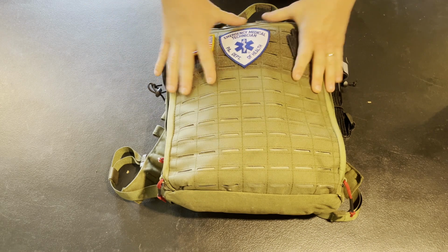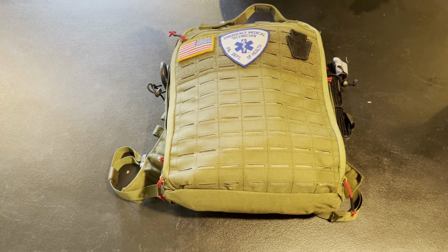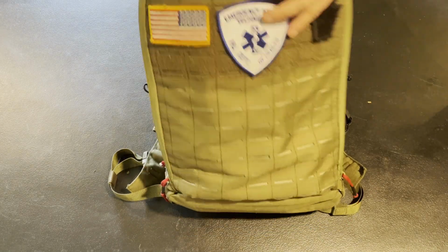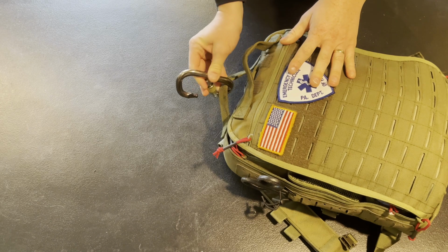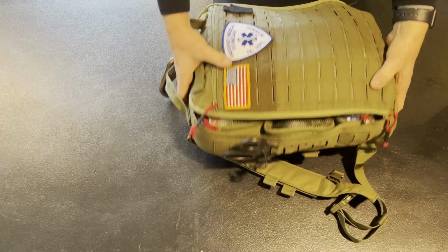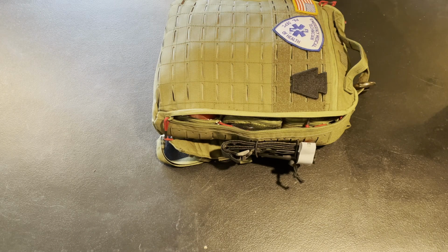The only thing that I don't have in here that I would normally have at my job is oxygen. That's it, yeah. Okay, so the bag itself I got from Amazon. It's nothing nice. I do like that it has the clamshell that opens up this way. On the outside I have a large carabiner, so that way I can clip this onto something and hang the bag and it opens up. On the side I have some trauma shears, and on the other side a tourniquet. Just some quick, grab it immediately.